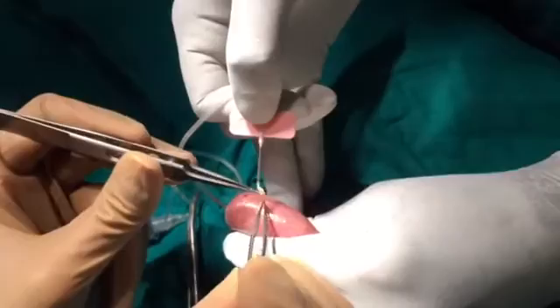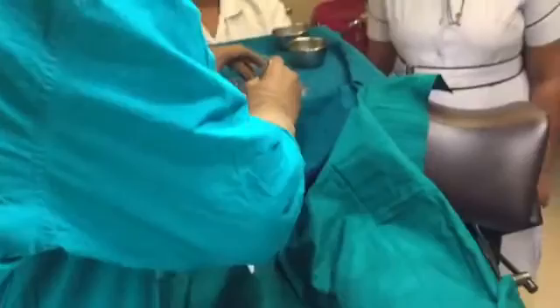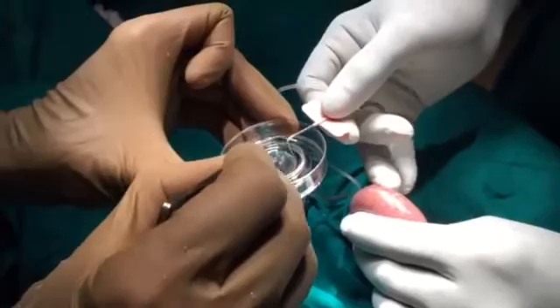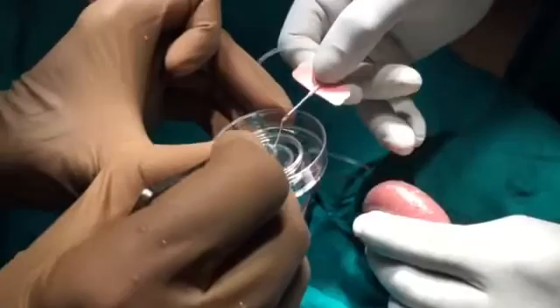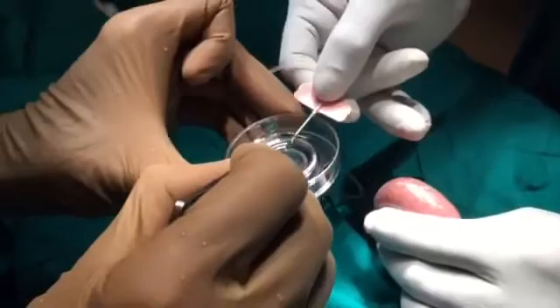I'm pulling out the tissue now — these are testicular tubules which we can now send to the lab. The beauty is we've not needed to open. You can see there's so much tissue; it's nearly like an open biopsy, but from the patient's point of view it's much more comfortable.